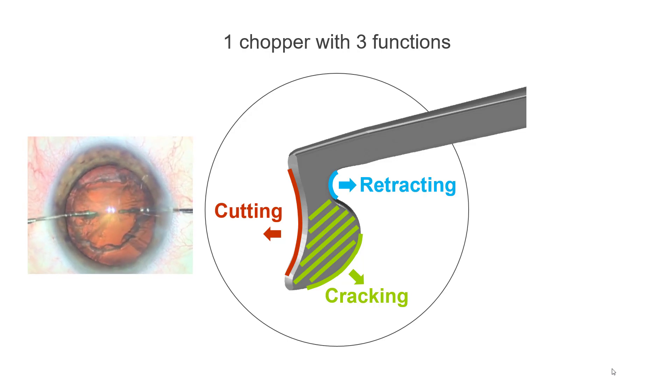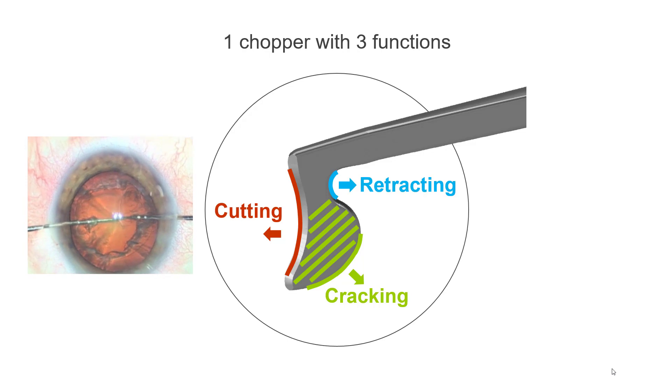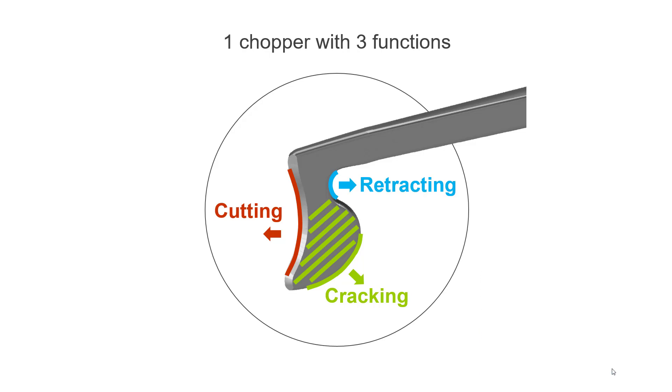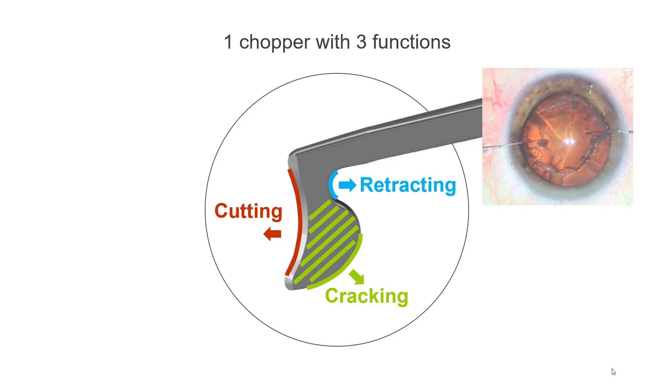Example of B-manual forward chopping where forces are directed towards the center of the nucleus, avoiding stress on the zonules and capsular bag. Example of cracking the nucleus into two halves with a B-manual lateral movement. Example of retracting the capsular rim with a B-manual movement towards the equator.